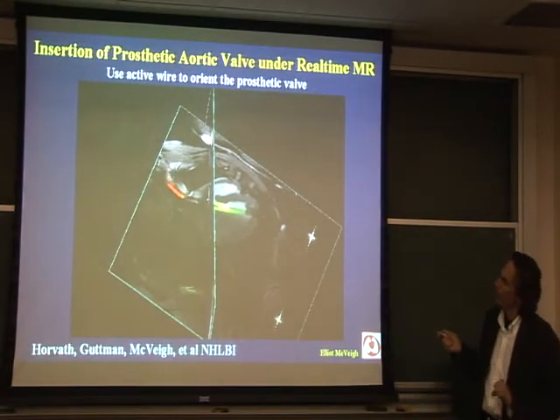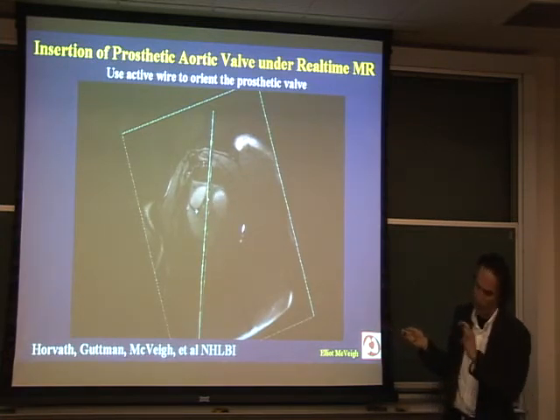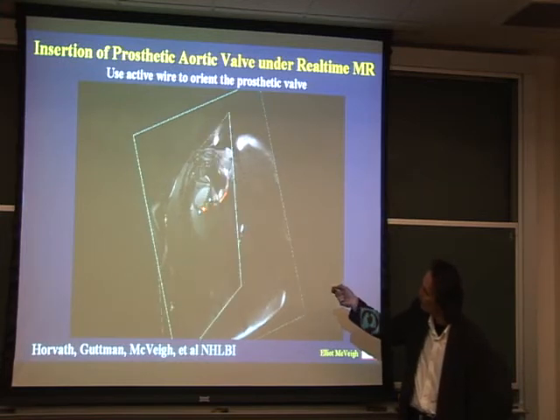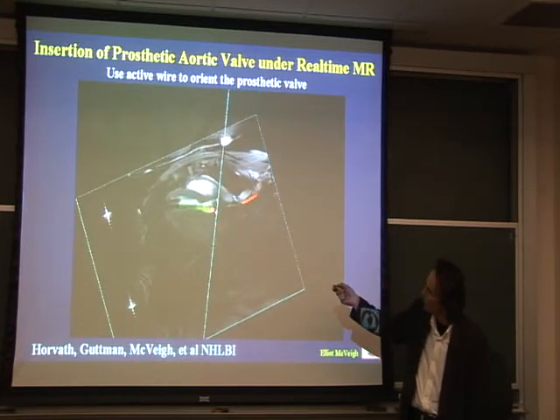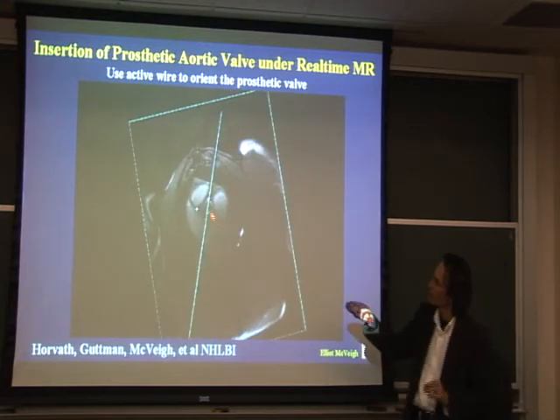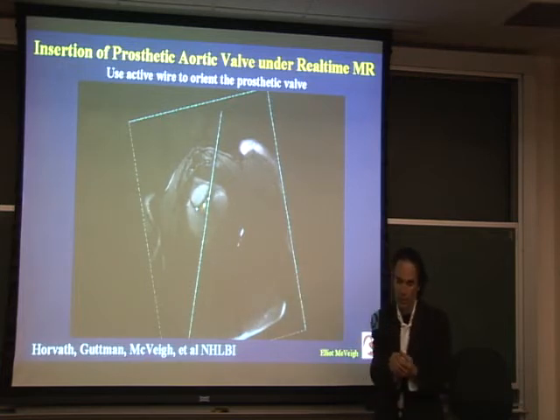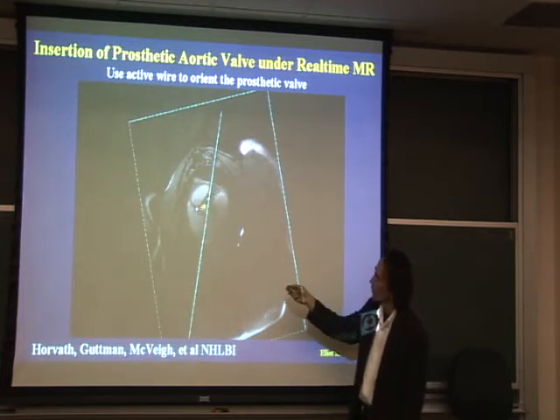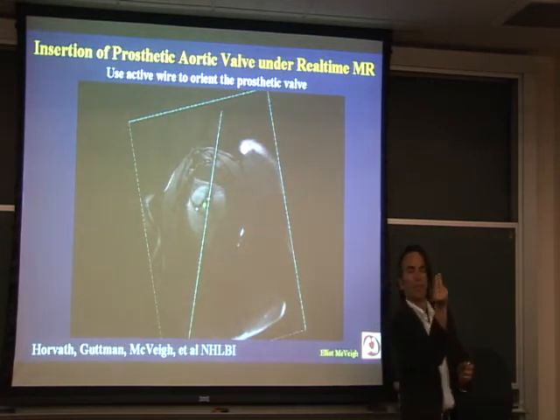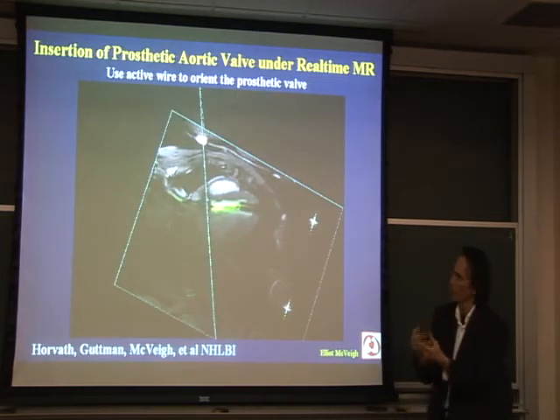The valve itself has a guide wire coming through the center, and also another wire tied to the outside so that you can orient it. You see that little green dot? The yellow dot is put on by Mike as the aortic annulus. Two blue dots, this one and this one, are the origins of the coronary arteries. The game here is to rotate the valve so that the green dot goes between the two blue dots. When the valve opens, it will then not cover the two coronary origins, because it has three posts. If those posts land on the coronaries, it's a major problem, and the experiment is over in the next five minutes.